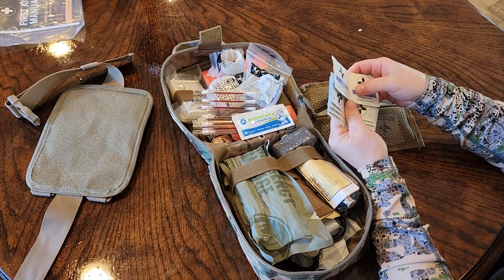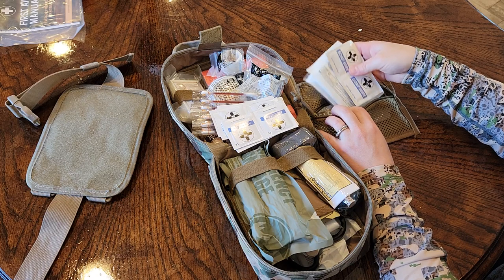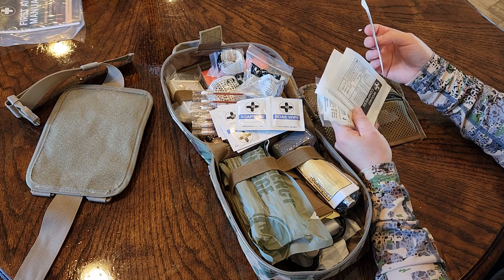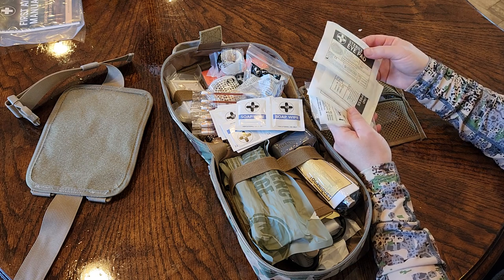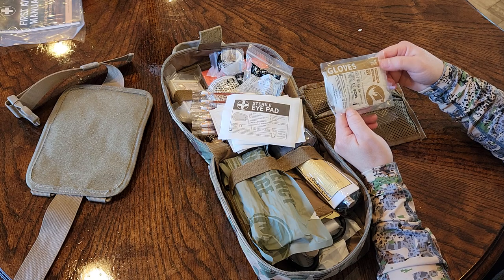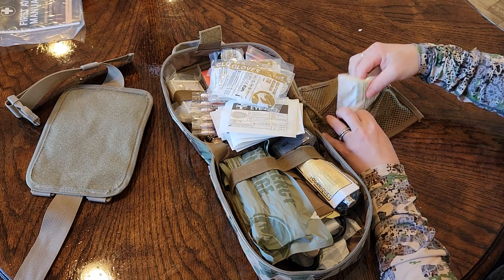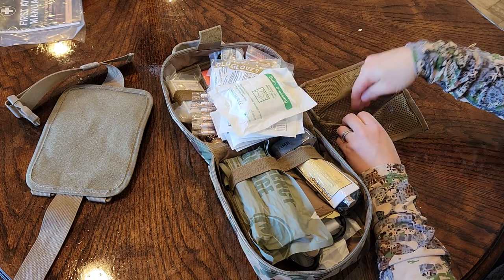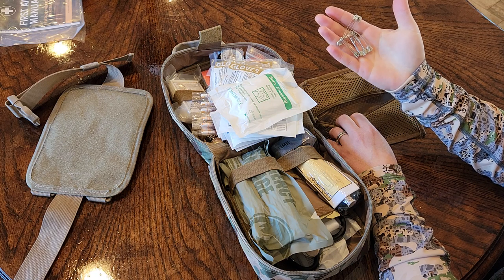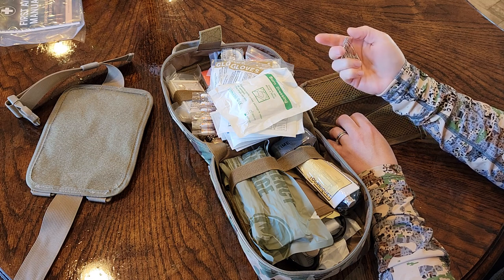Burn care, swabs, alcohol swabs, still a little bit of burning sensation. Good stuff. Soap wipes. Another thing I noticed they don't put in their packs, which the reason why is probably because they break open as ammonia pearls. That wouldn't be a good time if that broke in your IFAK, but nonetheless. Some of the things can break and screw your IFAK up. Gloves. We'll have burn dressing, and then they've got safety pins to pin your arm up if you don't have a big square piece of cloth that you can turn into basically a triangle bandage.